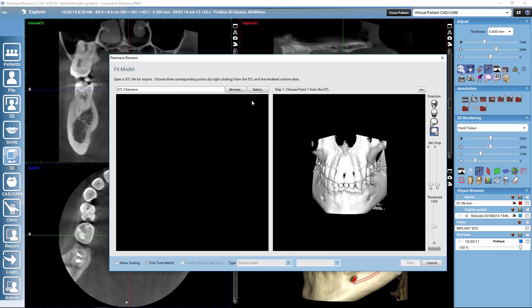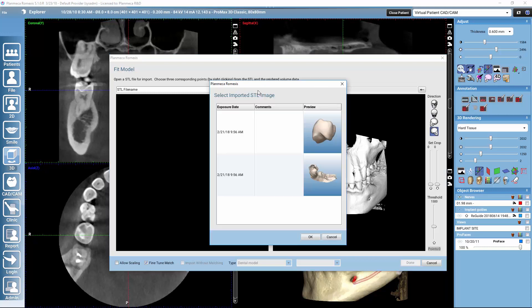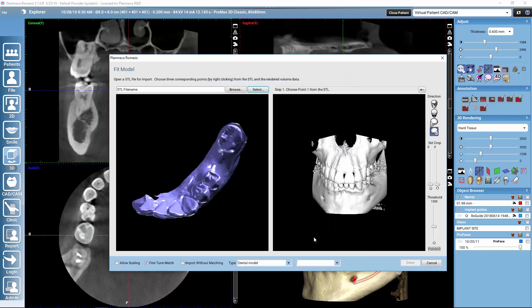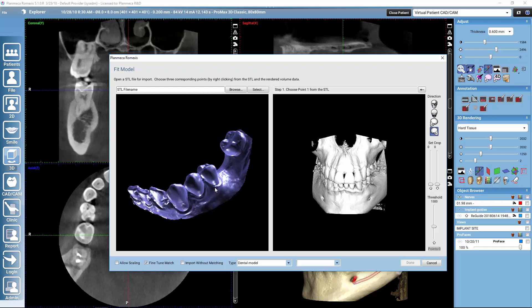We go to select and we see all the patient's STL files and we can select the intraoral scan. If you don't have the intraoral scan yet in the patient's files, from browse you can browse the files from the computer from any folder.